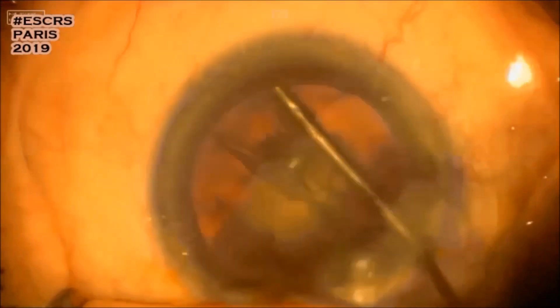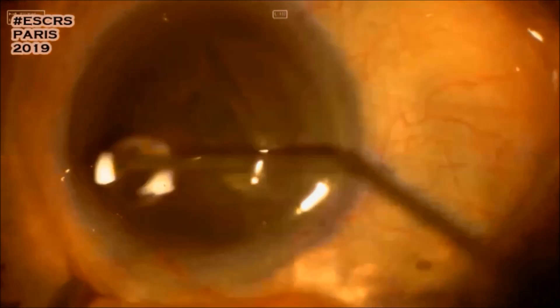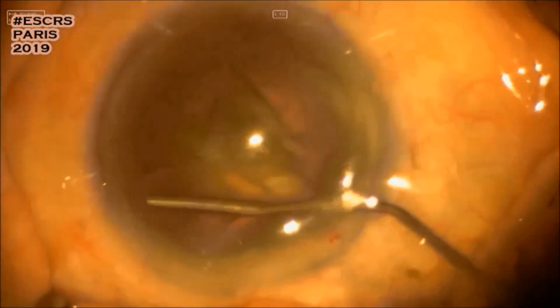Once the rhexis is completed, hydrodissection is performed — salt solution being injected slowly at different angles, and more fluid injected. Here we have the fluid wave.